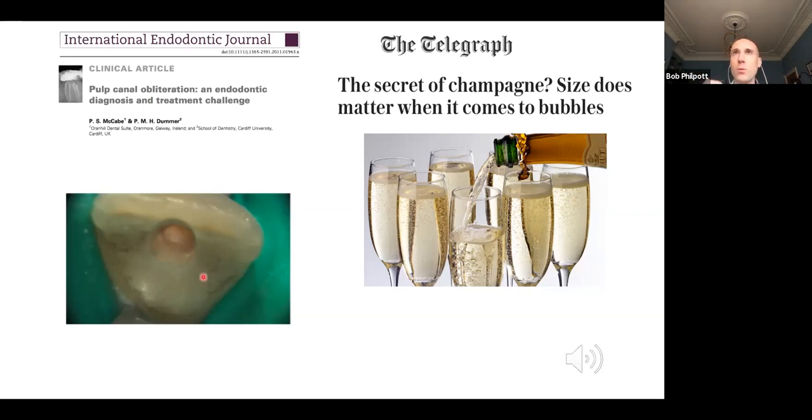And then people will say, well, what I do is I put loads of hypochlorite in, and then I wait to see bubbles. But you'll see bubbles from everywhere. It would be like looking for a 2p coin in a swimming pool, and someone saying, can you see it? And you say, I think, is that it down there? And you would identify loads of other small things that are often floating in swimming pools, but that weren't the 2p coin.